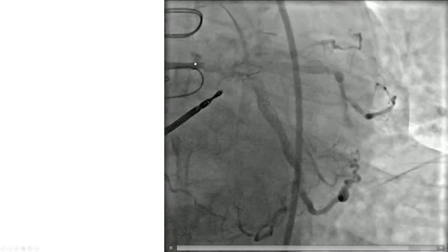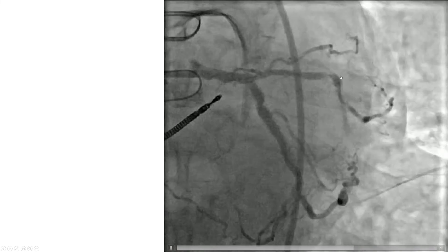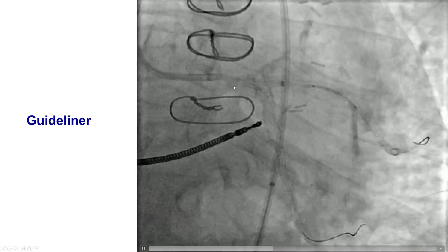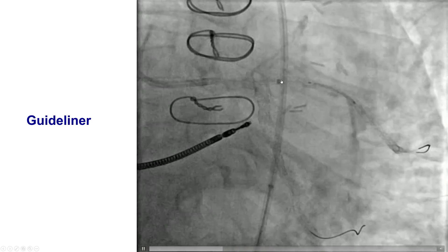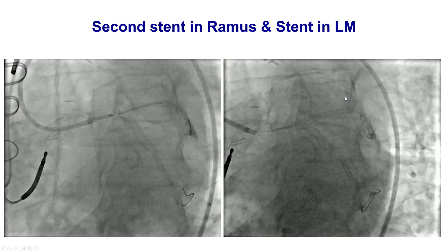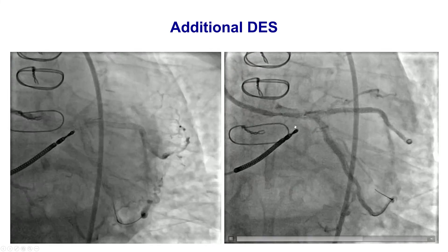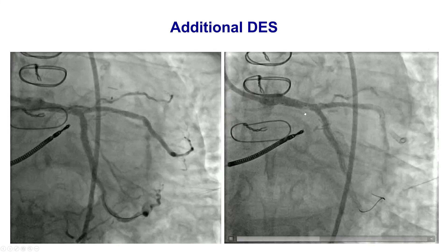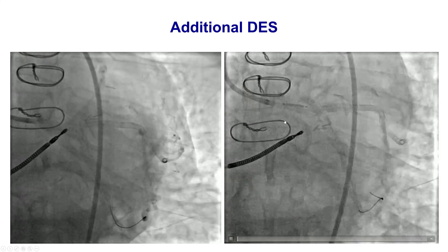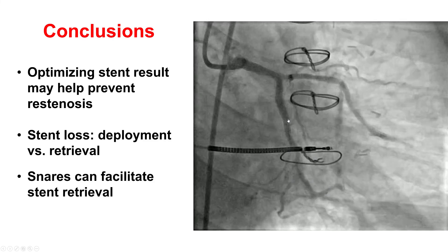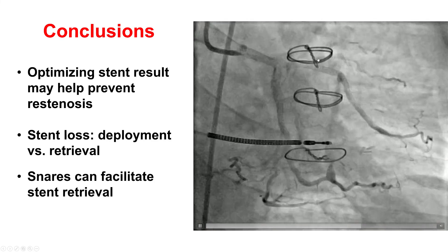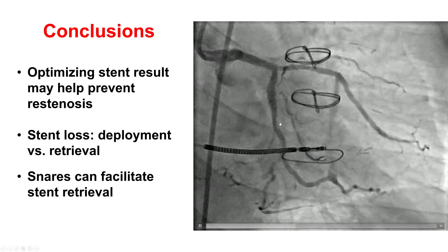We did have a small aortocoronary dissection; fortunately, we still had TIMI-3 flow in both the RAMUS as well as the 2nd obtuse marginal branch. This time, we dilated very carefully several times, used a guide catheter extension, and were able to deliver stents into the RAMUS as well as the left main. The final result was a left main bifurcation stent, which likely happened because of longitudinal stent deformation from deep guide catheter engagement. After multiple high-pressure balloon post-dilations, a nice result was achieved with TIMI-3 flow into both the RAMUS and circumflex.